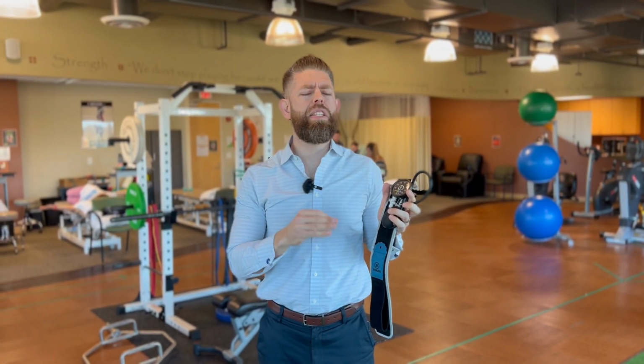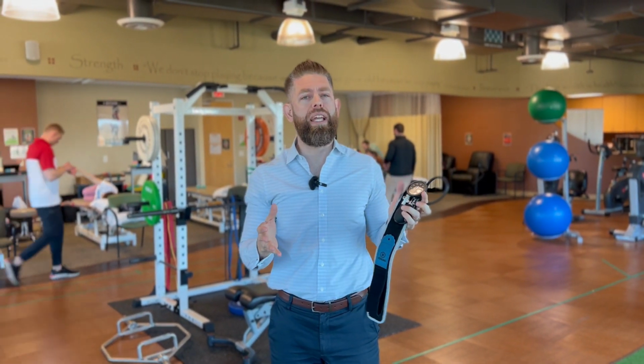Another potential limitation of the Be Strong system is that it does not specifically calibrate to the patient's limb. Instead, you just pump it up to the desired pressure and then let them go exercise. The positive on that is it's disconnected and the patient can move freely. The negative is it's not quite as precise as the Smart Cuff system. Hopefully this BFR spotlight is helpful for you as you try to integrate new technology into your practice.